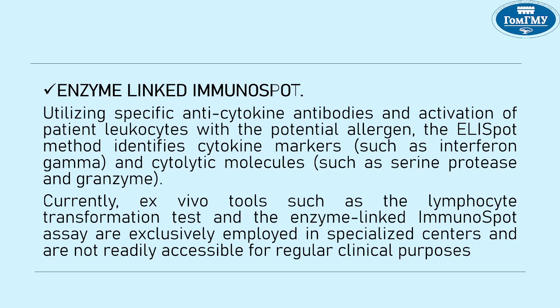Enzyme-linked immunospot utilizes specific anti-cytokine antibodies and activation of patient leukocytes with a potential allergen. The ELISpot method identifies cytokine markers such as interferon gamma and cytolytic molecules such as serine protease and granzyme.